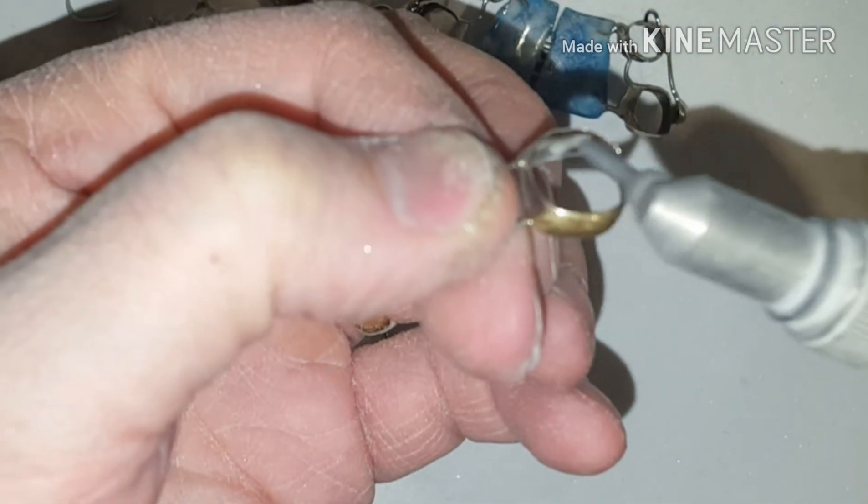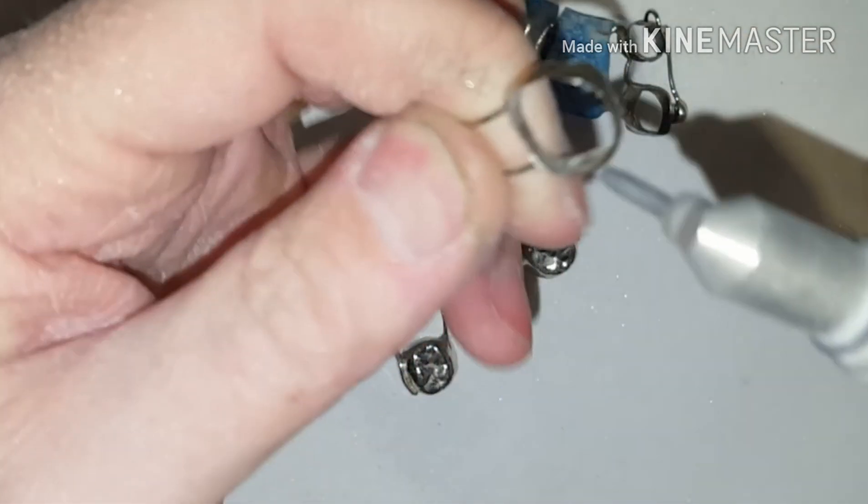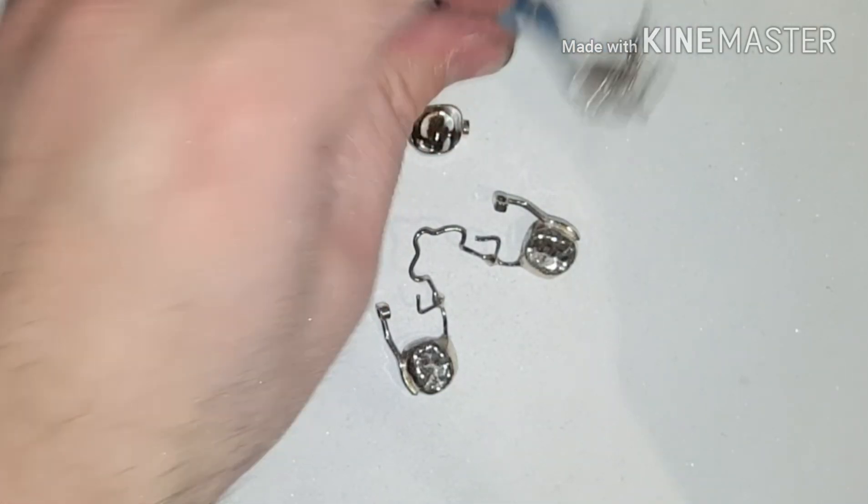Space maintainers — one of the biggest complaints is that they're a little too big or they're constantly falling out. By micro-etching the band, this will help the adherence better and reduce the failure rate.